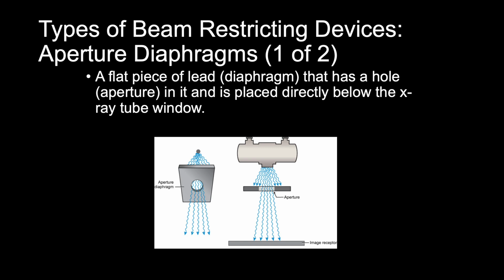And then for X-ray field size, if we're increasing the X-ray field size, which means we are decreasing collimation, the patient dose is going to increase, the scatter is going to increase, radiographic contrast will decrease, and the quantum noise will decrease as well.